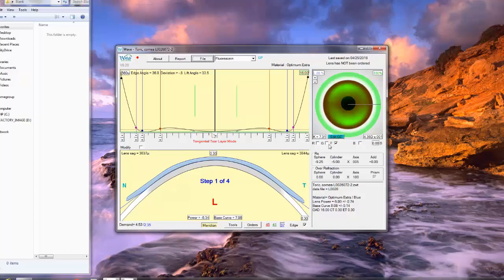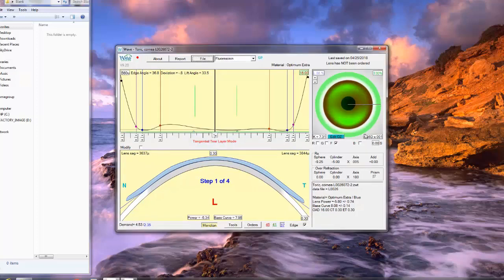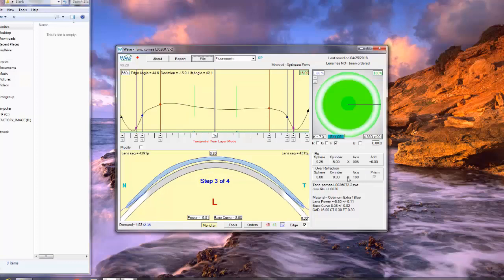You can always change it to a geometrically symmetrical or a rotationally symmetrical design, but keep in mind when you do that, you're not really changing the geometry of the interior of the lens significantly, and you are impairing your ability to fine-tune the fit where it matters out there in the periphery of the design. Here's our 16 millimeter lens. Again, being very careful to touch all the way around. We're going to have a much broader alignment area with a design like this and still be clearing the limbus at 12 millimeters.